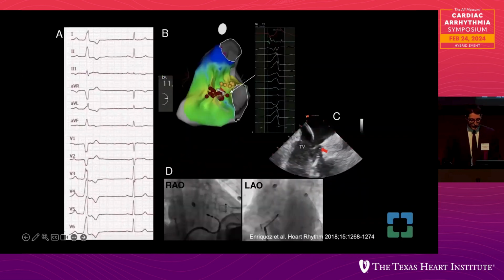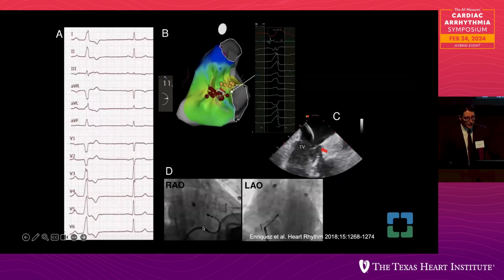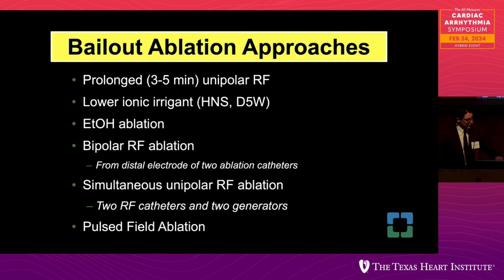And again, the best approach, and we can discuss later, is looping the catheter backwards and protecting your catheter by the septal leaflet of the tricuspid annulus. How do you achieve that? Typically, you need a deflectable sheath here. We like to use a large curl sheath, deflecting down to overcome the issue with the eustachian ridge, and then looping the catheter backwards here in the parahisian location. And here you can see on intracardiac echo that the septal leaflet is protecting your catheter from shifting backwards, because everything will be moved with the septal leaflet anterior and posterior without going to the atrial side.